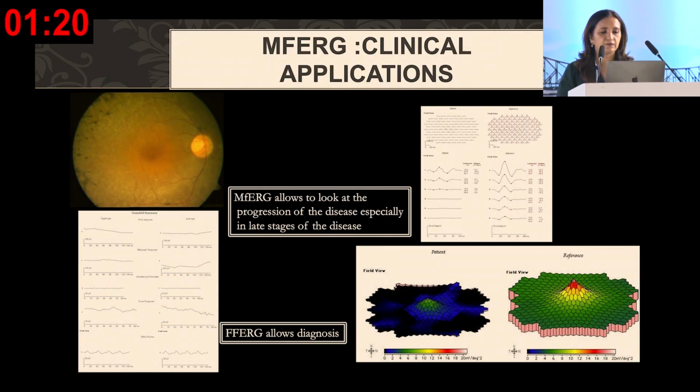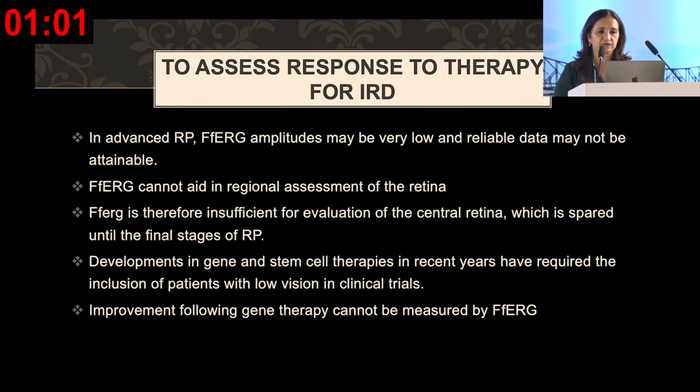So here again, full field ERG is extinguished. So it's a patient of retinitis pigmentosa. If you want to follow up the patient and the patient says, am I worsening? How would you do it? You record a multifocal ERG itself, and measure the topographical area where you are seeing responses vis-a-vis the fields. These are two things which can help you assess progression of disease.